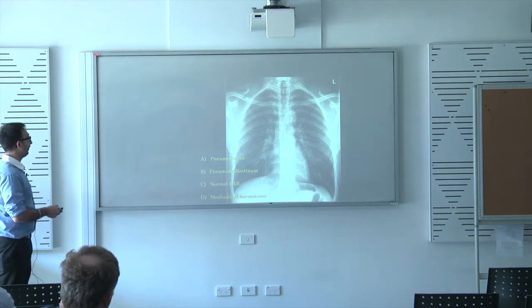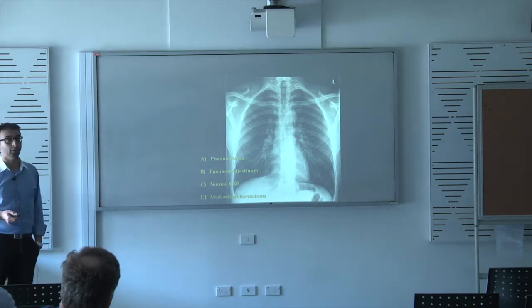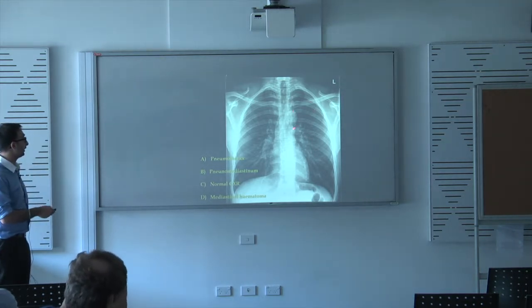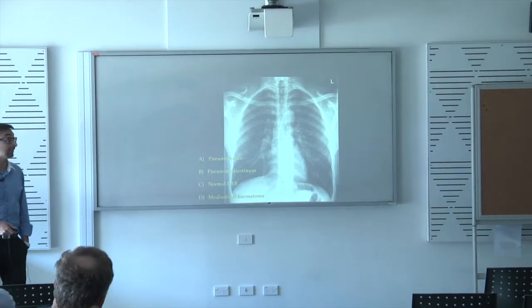Ideally in pneumothorax, you'd see the visceral pleural line, and the lung markings go out symmetrically. You can miss a pneumothorax on a film, and sometimes an expiratory view helps accentuate the pneumothorax, and you can pick it up on that. The mediastinal contours are pretty good. There's no paratracheal abnormality. The aortic outline looks normal, so that would go against an aortic injury.